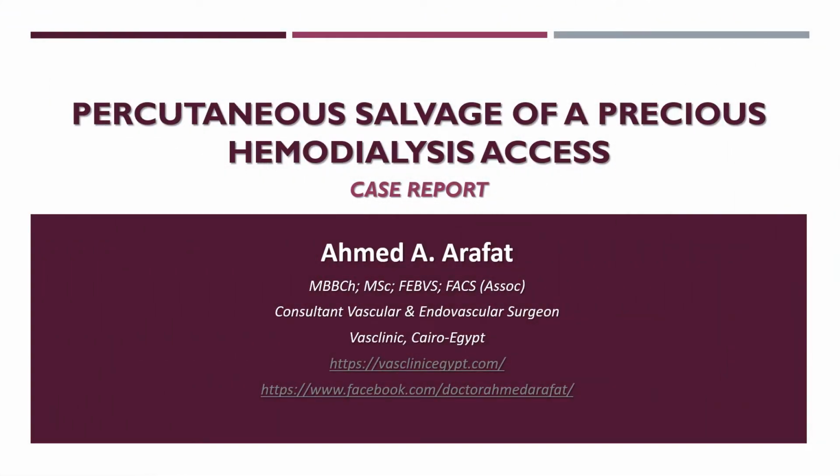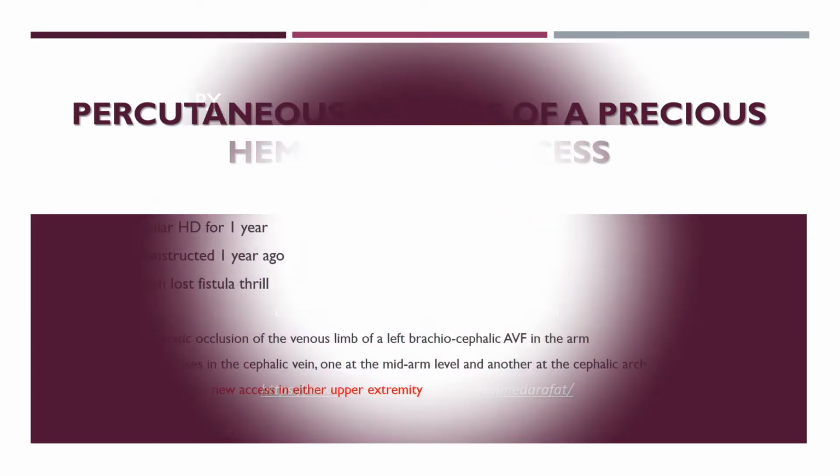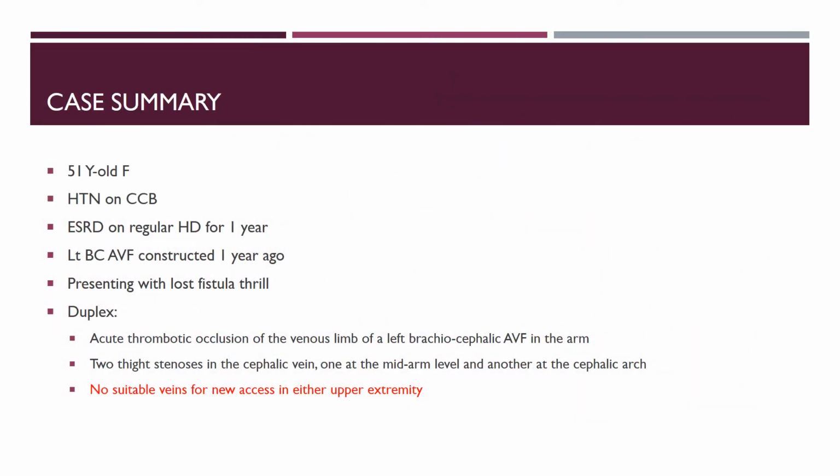Percutaneous salvage of a precious hemodialysis access. Case report. Case summary. 51-year-old female. Hypertension on calcium channel blocker.